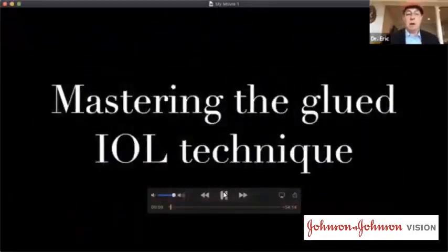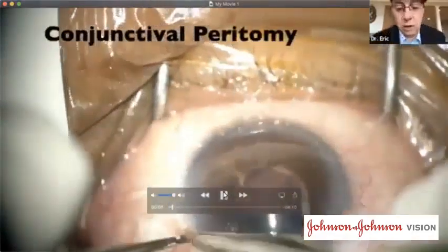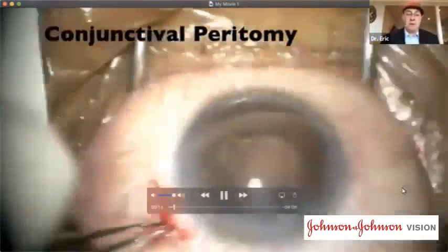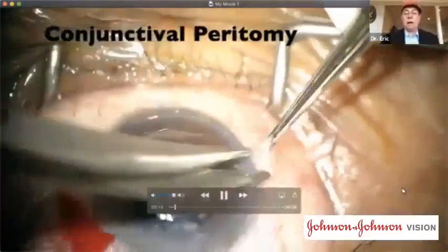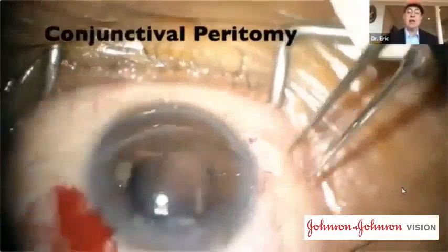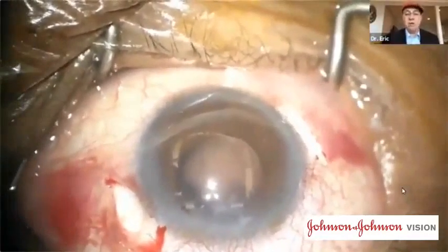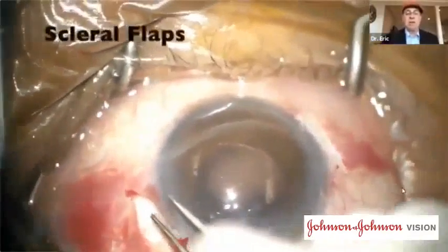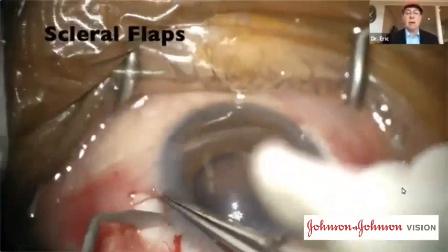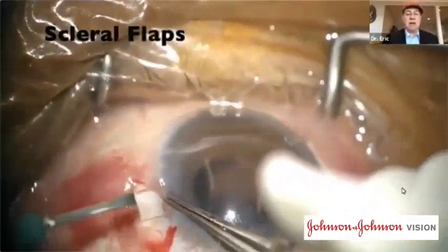Good. All right. Well, I'm going to be speaking about the glued IOL, and I don't want to sound like I'm pandering to Amar here, but I would go out on a limb and say that this might be the most important technique on IOL technology since the development of the posterior chamber lens. This has revolutionized the implantation of a posterior chamber lens and has really made IOL implantation in the most difficult cases within the realm of almost any surgeon.